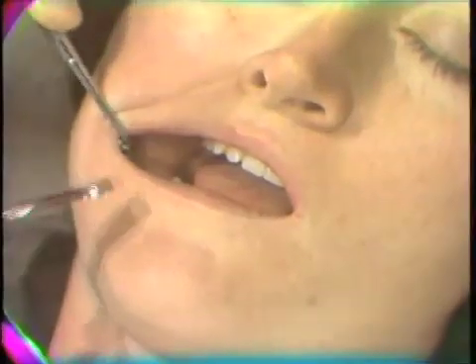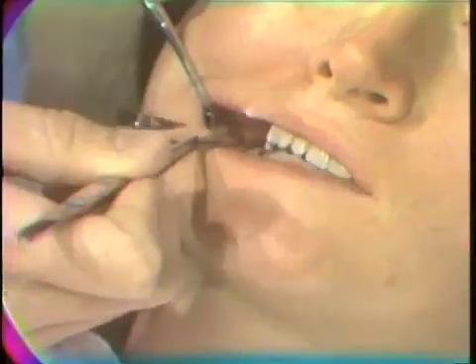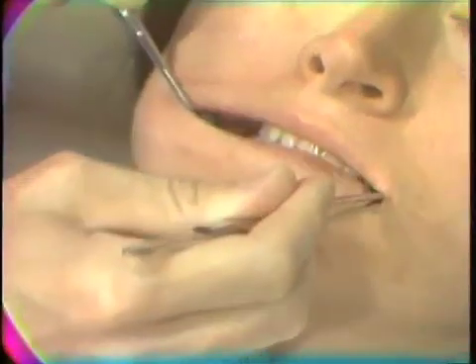After complete removal of the residual cement, one other thing that should be evaluated is to be sure that the occlusal relationship has been maintained — established prior to cementation. So with shim stock, going around the mouth. There is maintenance of balanced occlusal contacts on the centric stops around the mouth.